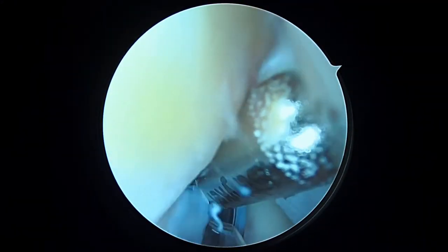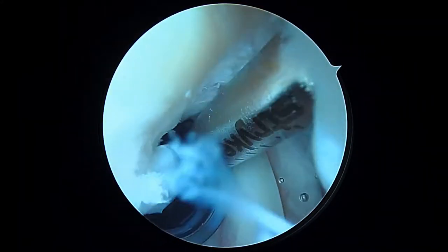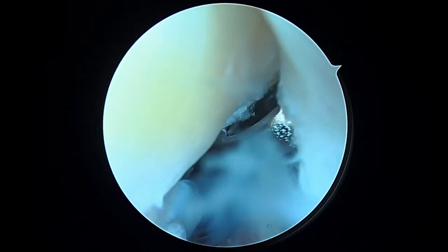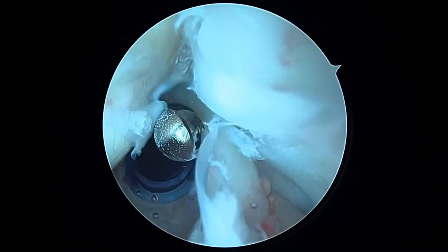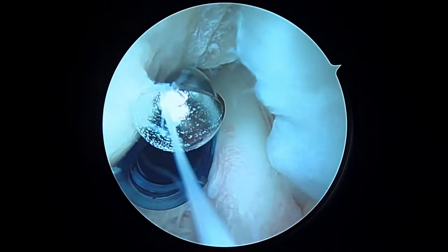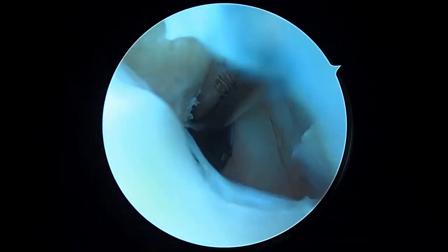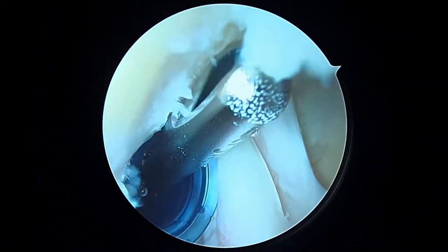The rotator cuff tear, however, is this area right here, which is what we expected to see. This is all rotator cuff footprint that's exposed — it's not supposed to be exposed. That's where we're going to be working, so we'll have a suture anchor ready to go, shuttle relay, and all the things we need to repair the cuff here.